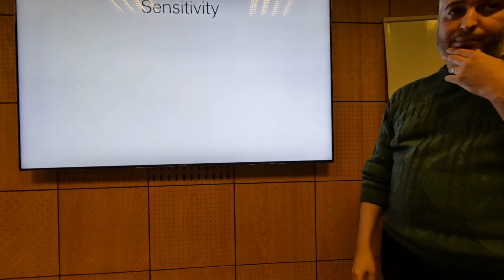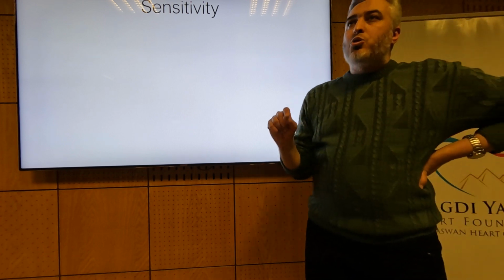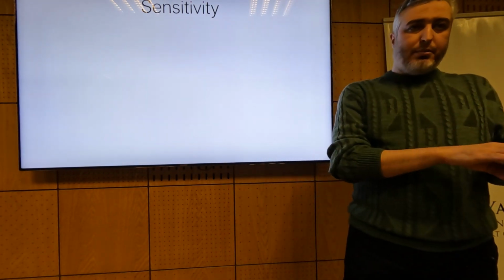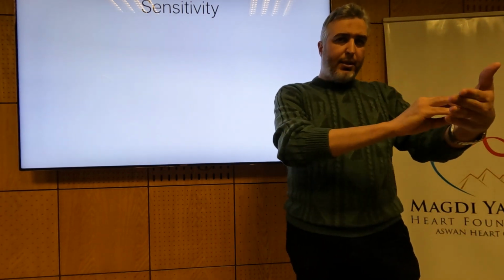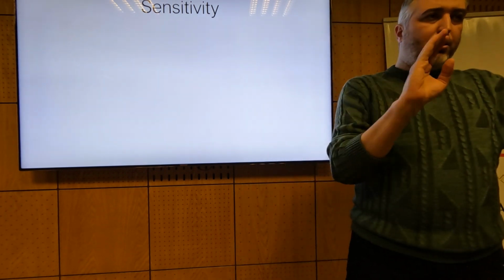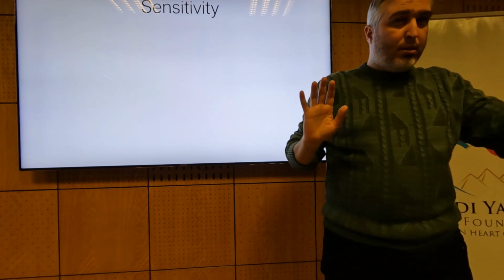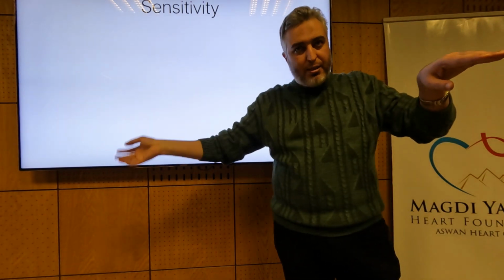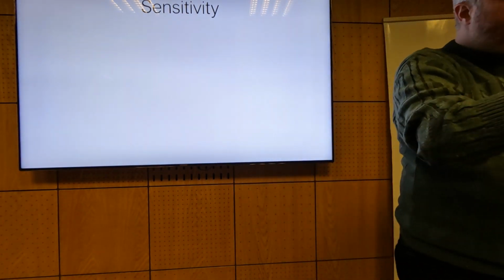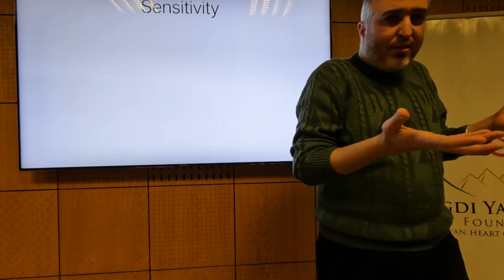What is sensitivity? This is a bit tricky. We tell the pacemaker that there is a pacing lead attached to the chamber that is being sensed, and you instruct the pacemaker that any electrical activity above that set number should be considered as activity, and then do whatever the response is supposed to do. So if you're inhibiting pacing, if you find that activity, just inhibit pacing. Why don't you just sense anything, and then be very sensitive?